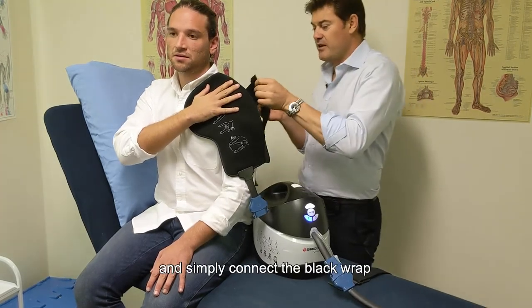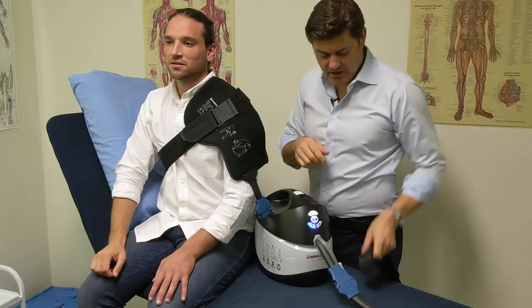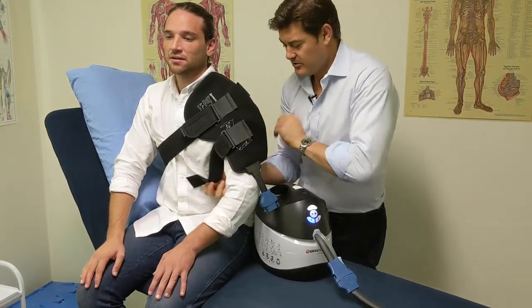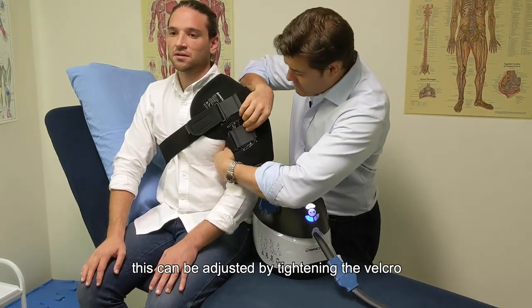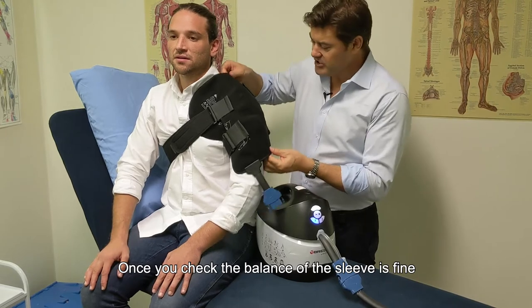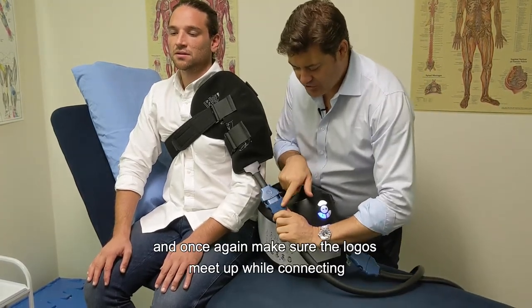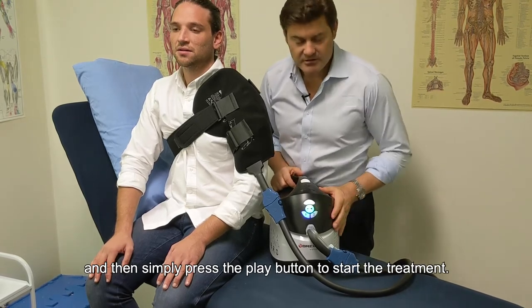Once correctly oriented, connect the black velcro wrap to the wrap itself, then the second one. For the arm velcro wrap, look for the black square that attaches to the velcro — put it on first, then reach under the armpit to secure it tightly at the back of the arm. If there's any looseness in the sleeve, tighten the velcro for a firm but not overly tight fit. Once the fit is confirmed, connect the pump sleeve to the extension valve — logos together — check there are no kinks in the hose, then press play to start treatment.